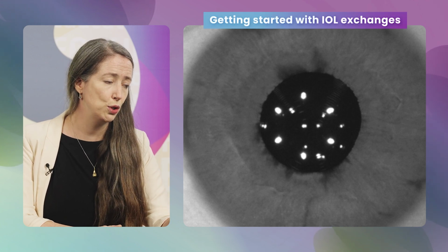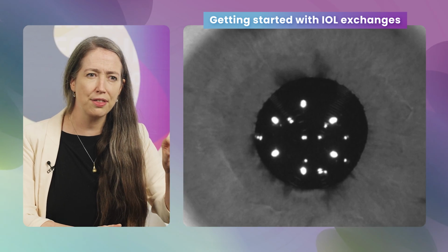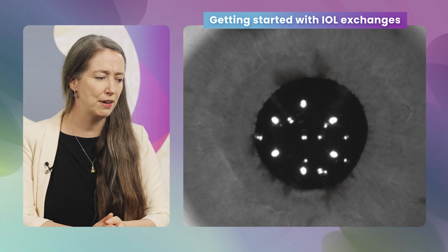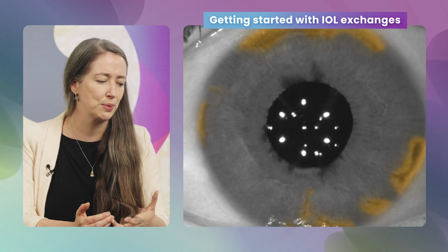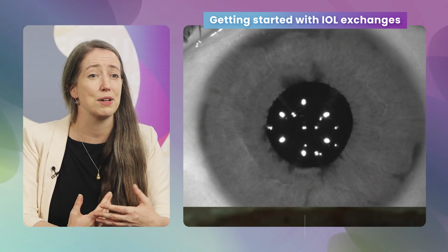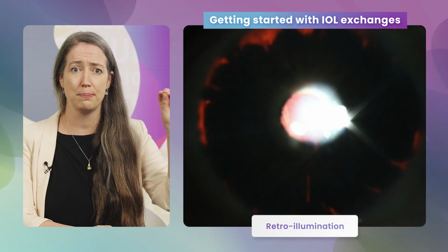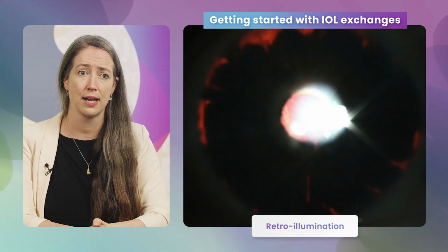If you see on this pupil, there are dark moth-eaten appearances around the central ring of her pupil. And in the periphery, you're seeing these dark spots too. But when I took her to the slit lamp and performed a very simple retroillumination, we see that she has vast positions of loss of iris pigment.